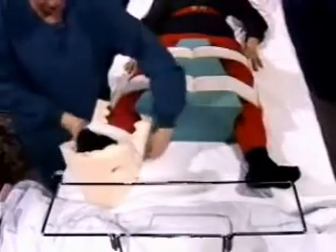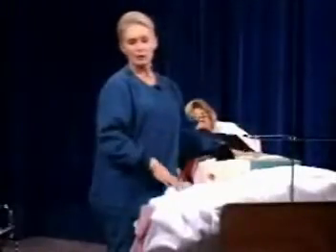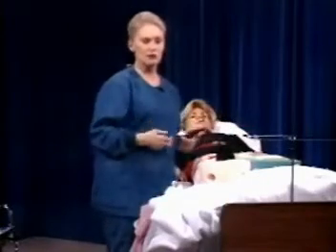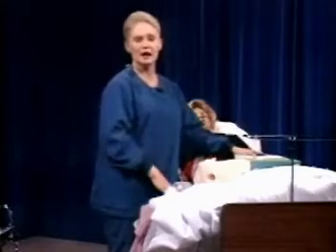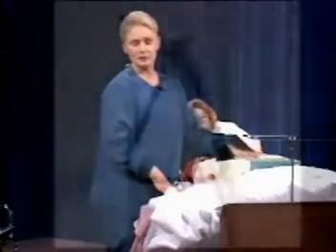And again, they should not be pulled tightly onto the patient, because this could cause added edema and swelling and pain. It should also be noted that in your immobilized patient, the foot of the bed should be elevated when the patient is in bed in order for the edema and swelling to run toward the body. We're now going to take a look at a trapeze.